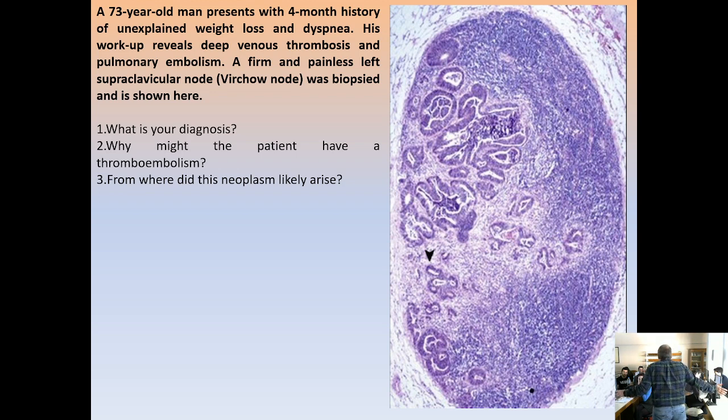So, what is the cause of lymphadenopathy in this patient? Can you find the differentiation of the foreign tissue? Is the foreign tissue adequately differentiated to think where it could come from and enter the Virchow's node? What do you say on this? Who can tell me? We see tubular structures. If we see tubules, which form of tissue in histology forms tubules that you've studied in histology? Which tissue forms tubules? Yes, please.